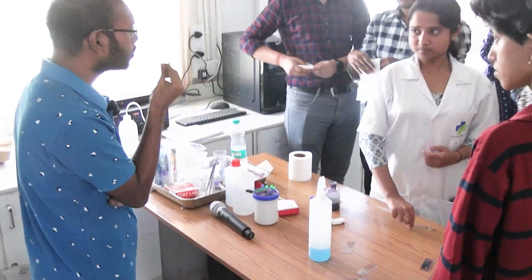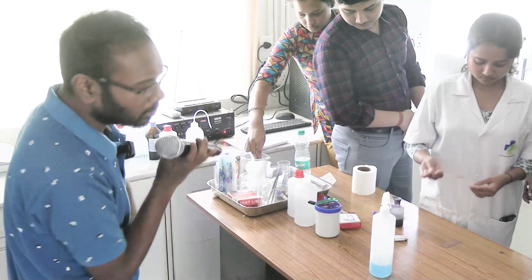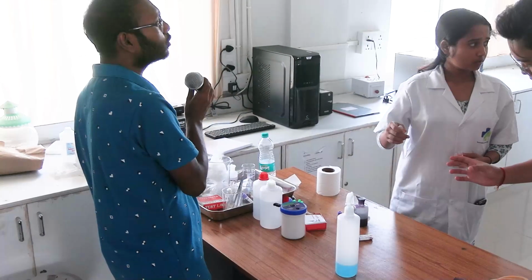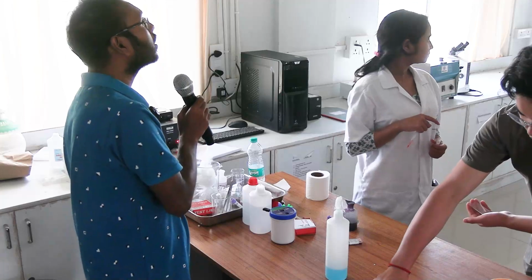Okay, Aziza ma'am is saying 3 people stay in one group and collect your slide first. The first droplet blast is there. If you need anything, yeah.